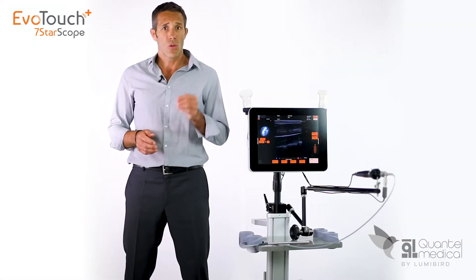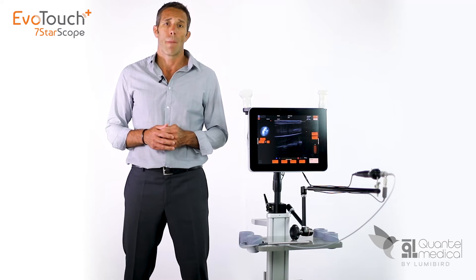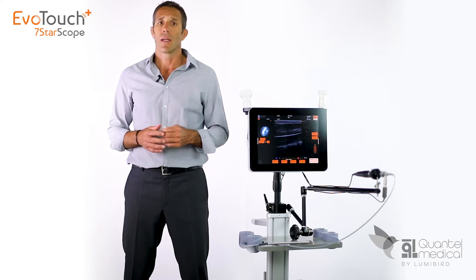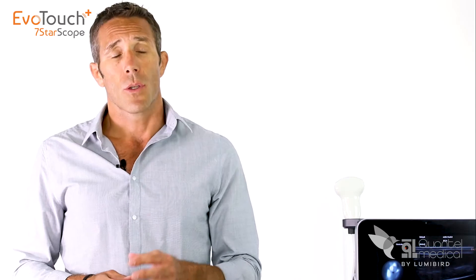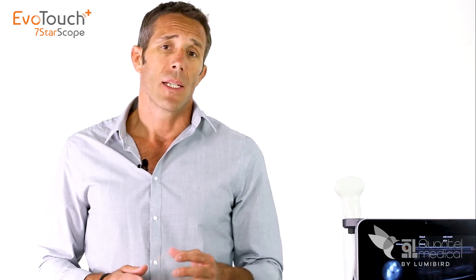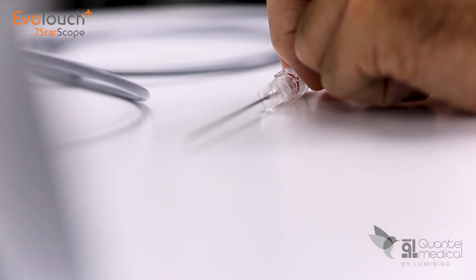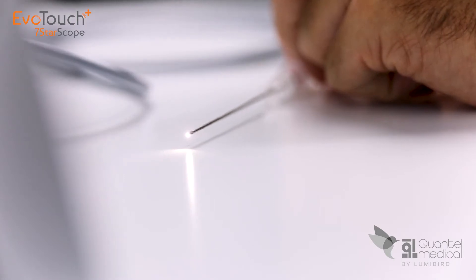These two medical devices combine two innovations in a single machine. The first: you will find in the same screen and the same interface an ultrasound scanner and a micro endoscope. The second innovation is based on the formidable fineness of this micro endoscope, which allows us to insert it into an 18-gauge cannula.